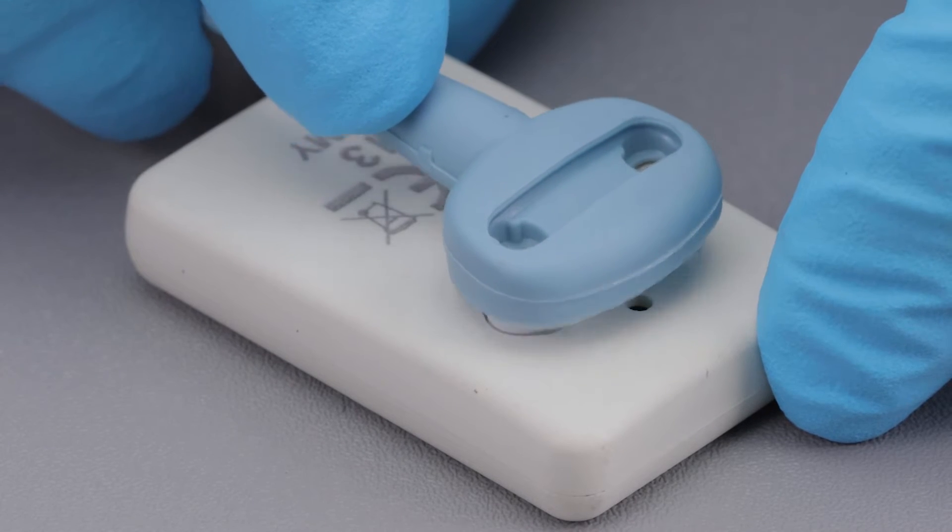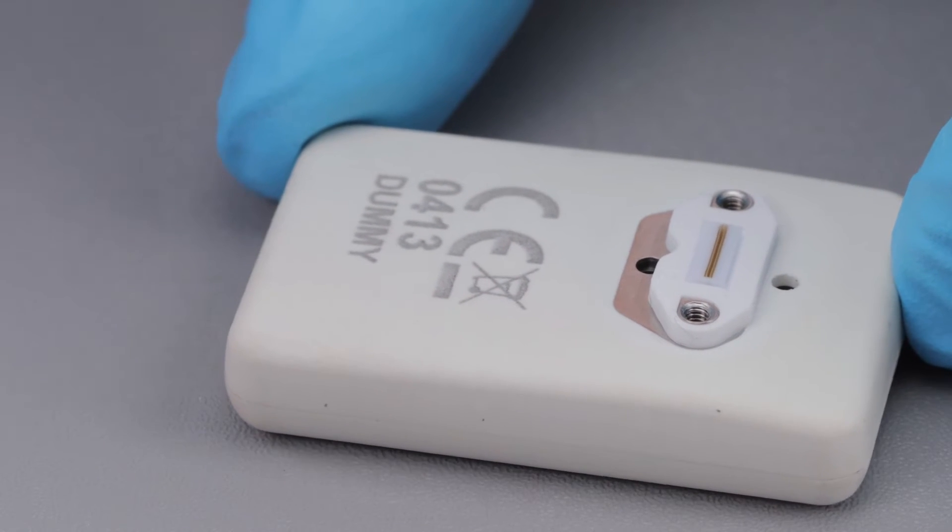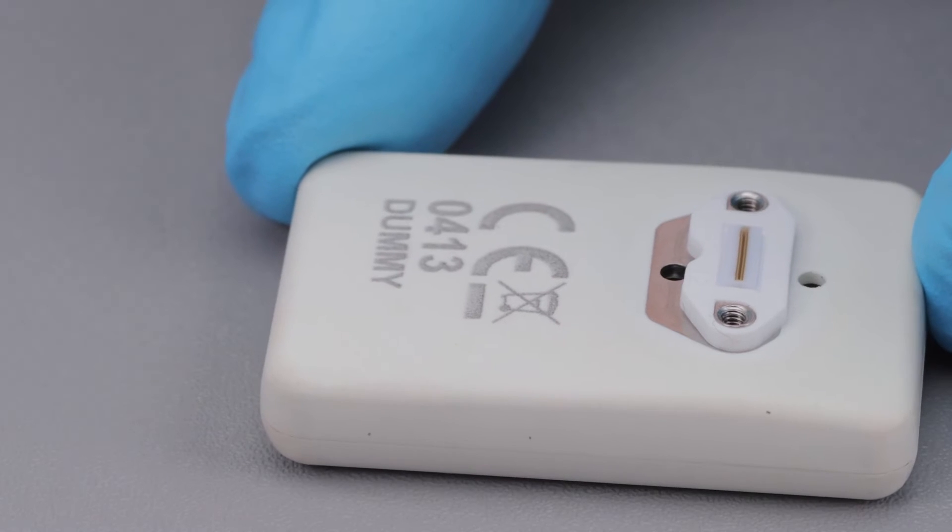Now remove the cable from the sensor. After removing the cable, you will notice an elastomer, or frame and strip, that helps connect the cable to the sensor.